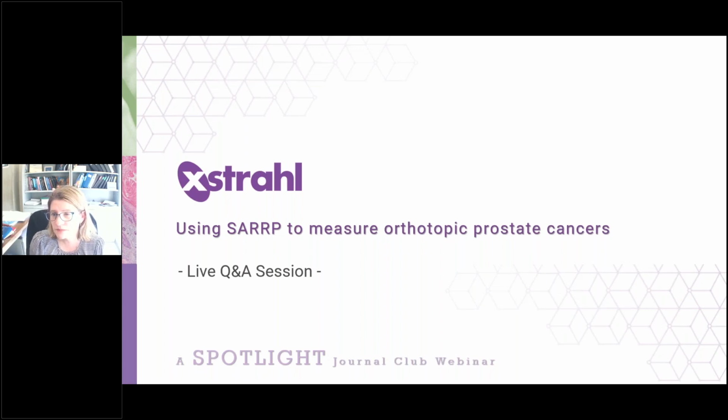Okay. Then relating to this, on our SARRP, we often take CT image of 2 mice at the same time. Would this technique be feasible on multi-mice CT images to facilitate throughput? We have not tried that. My guess is that you might be able to do 2 if they're really separated from each other, but I think it makes it more difficult to get the contrast set up so that you have a good picture for each mouse.